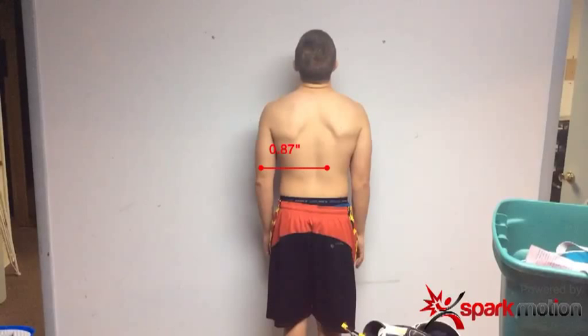I'd also like to take the measurement tool and have a fixed known in the field. So what I've got are two marks on the wall that are 36 inches apart. Using the calibration tool, I can change it to 36 inches, and now everything I measure has a new fixed point.